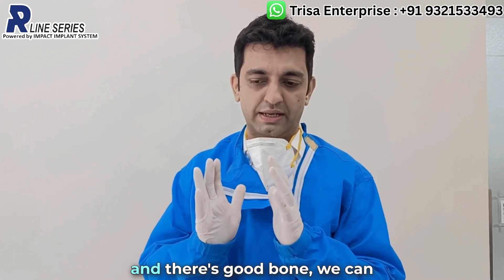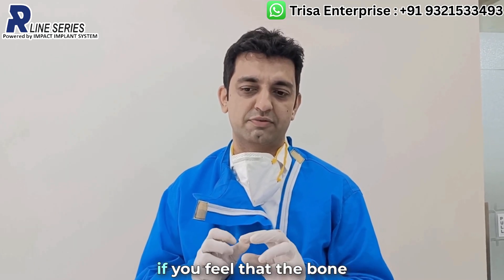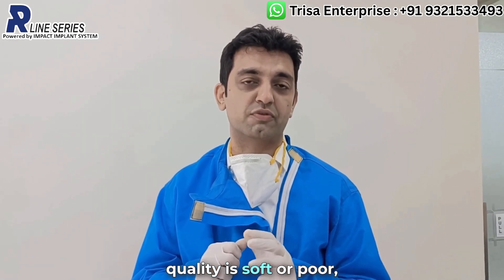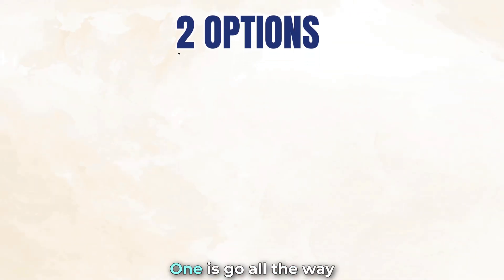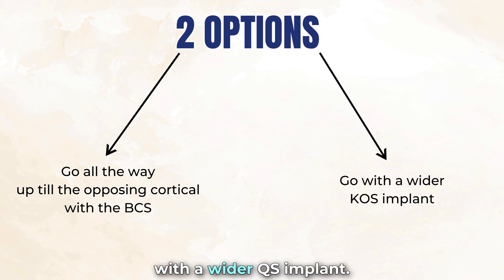If the bone quality is good and there's good bone, we can use a compressive implant. But if you feel that the bone quality is soft, there are two options: one is to go all the way up to the opposing cortical with the BCS, or go with a wider KOS implant.